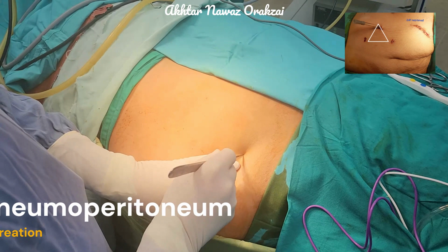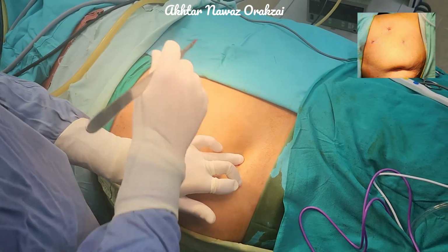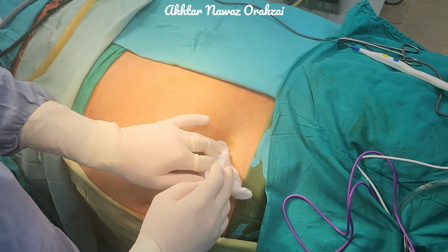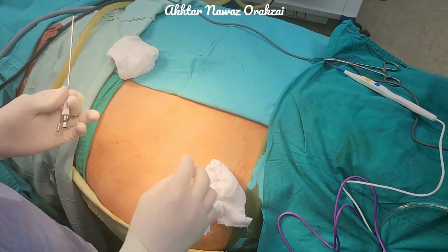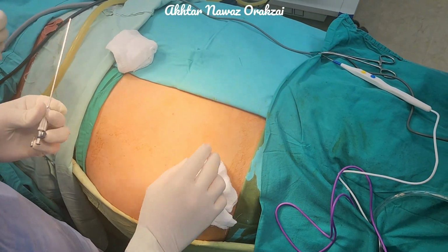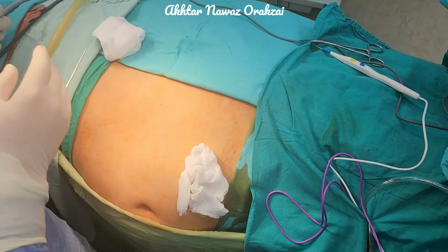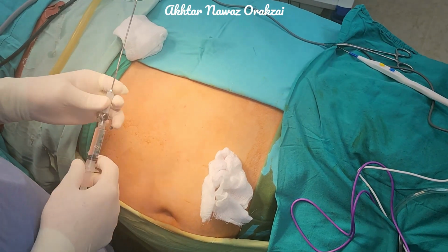Always remember that the final port placement is decided after the pneumoperitoneum is created, because all the landmarks change. They change after creation of pneumoperitoneum. The skin will be stretched and this will come here. So do not decide the port placement before creation of the pneumoperitoneum.